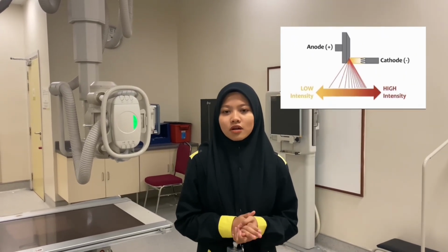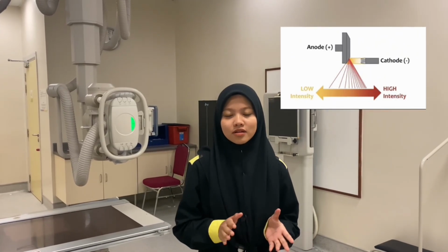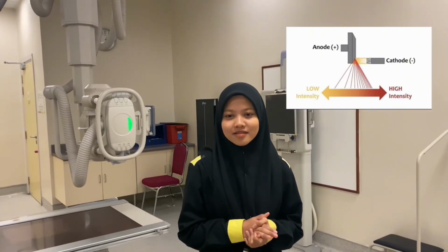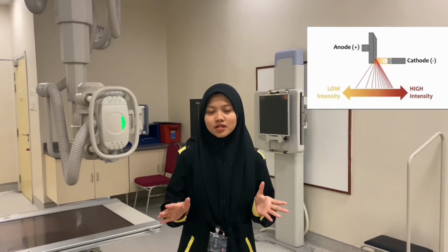This occurs because X-rays produced at the heel side of the anode travel through a thicker portion of the anode before exiting, resulting in higher attenuation, which is absorption and scattering of those X-rays. The cathode side X-rays travel through less anode material and experience less attenuation, making the radiation more intense.